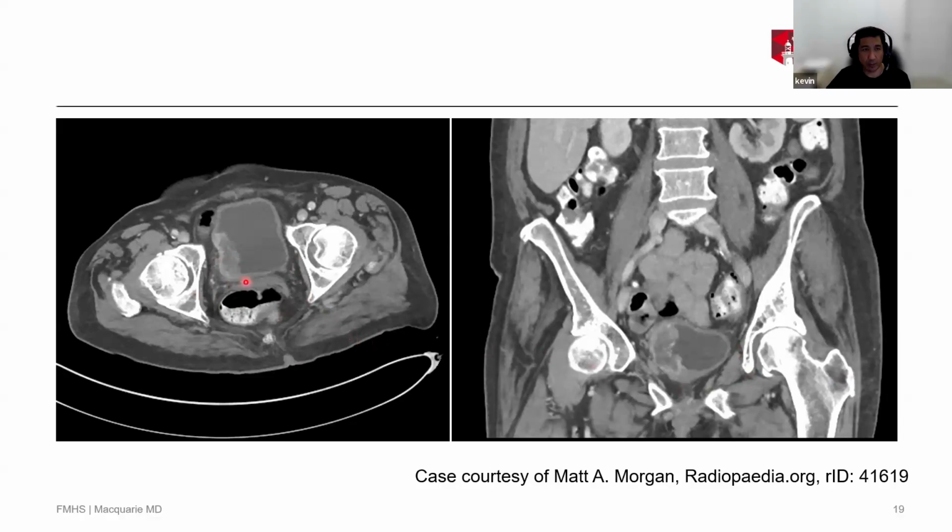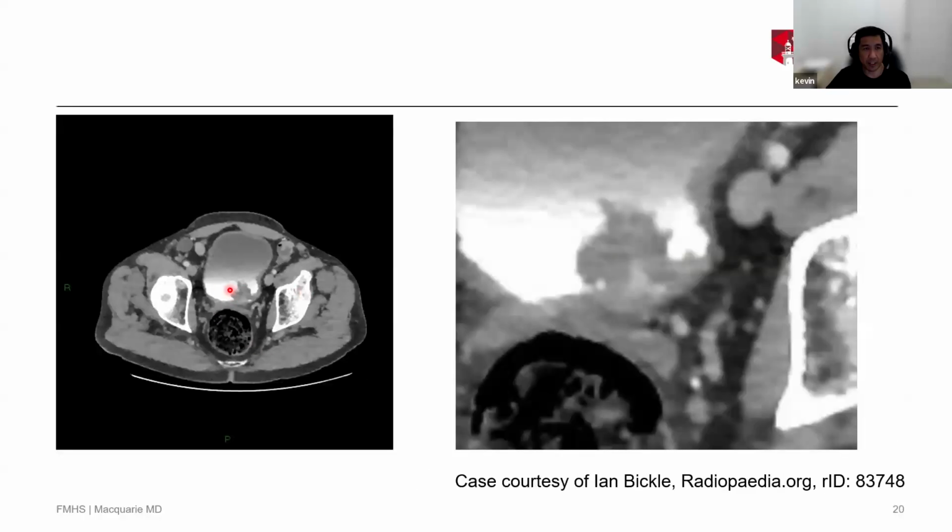So when we wait a bit longer, the kidneys will excrete the contrast and they'll start filling up the bladder. And then you get an image like this. So here the white is the contrast being excreted, and this is the unopacified urine. And you can see the structure sitting inside the bladder. I've just blown up that image to show you that you can see a little bit of the wall of the bladder. And you want to look for other changes, like has this penetrated through the wall of the bladder?